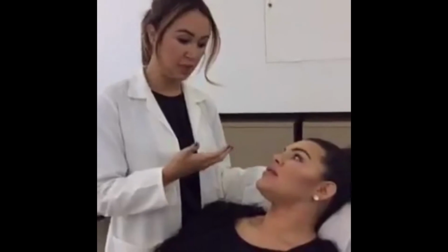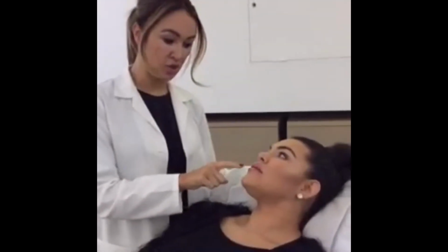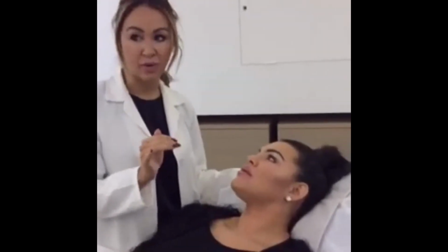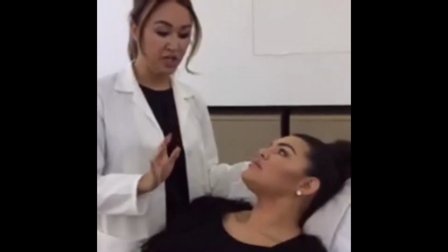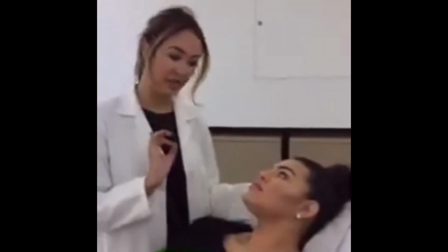Now, bearing in mind this has been live, and these are your lips straight after it's happened, so they're probably going to look a bit red. But then we can drop a picture in a couple of days. We've taken a good before, we'll take the after. Of course, initially there's anaesthetic in there, so she'll have a bit more swelling. We have done some extra work to contour the border, which is a bit puffier than normal. It will settle much more defined. So for 24 to 48 hours, completely leave them alone. Go home with your aftercare, just apply it and massage a touch, and after a day or 2, and even up to a week or 2 weeks, is when they're going to be at their best.